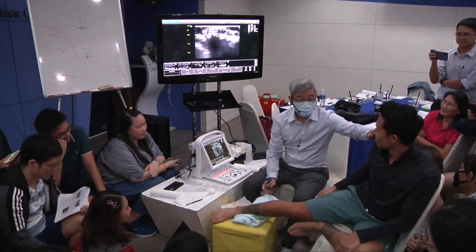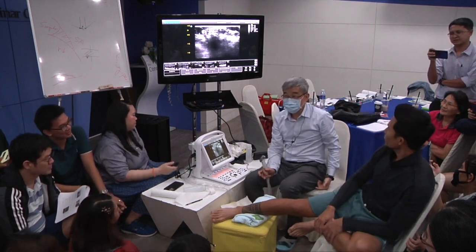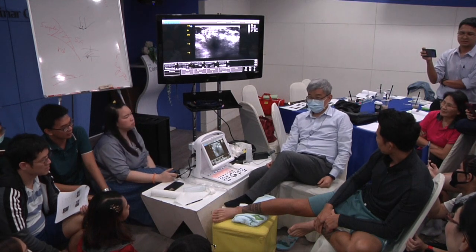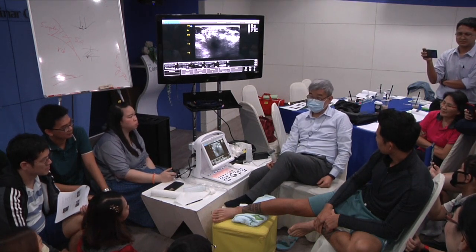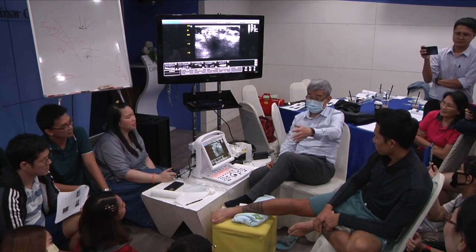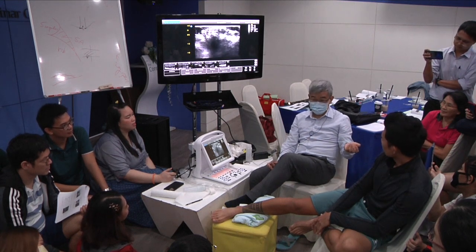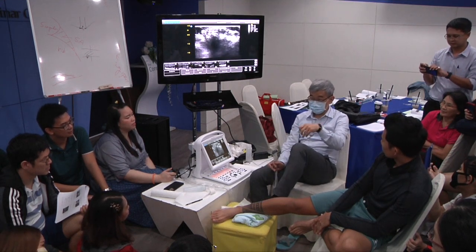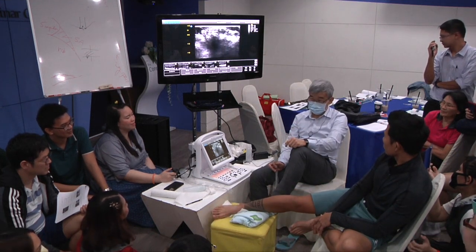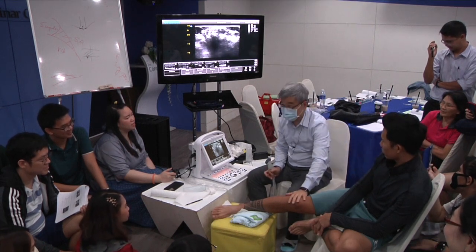Okay. In the old time, when I was a student, the standard positioning for ATFL is long sitting, bend knee. Now a couple of us, we change it to this position. We think it's better, so more easier. So if you look at someone using long sitting position with a bend knee, it's old generation style. Young generation use this kind of. Okay, easy.